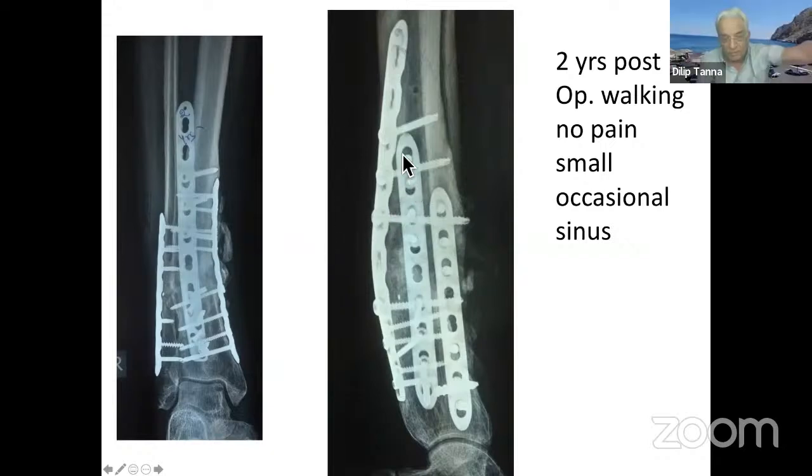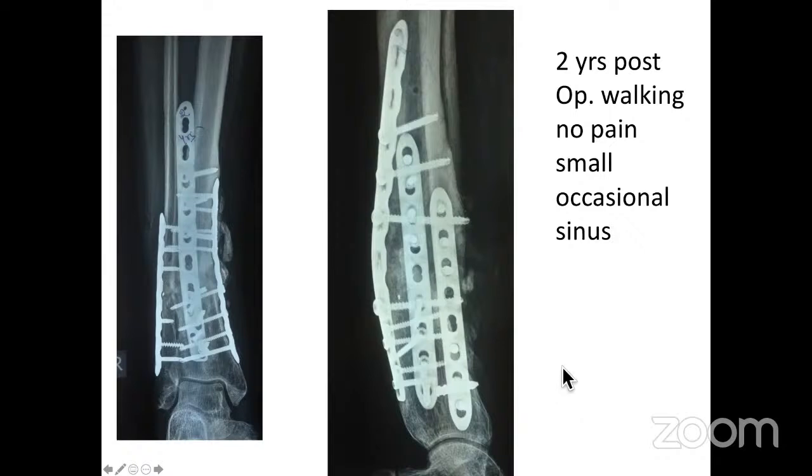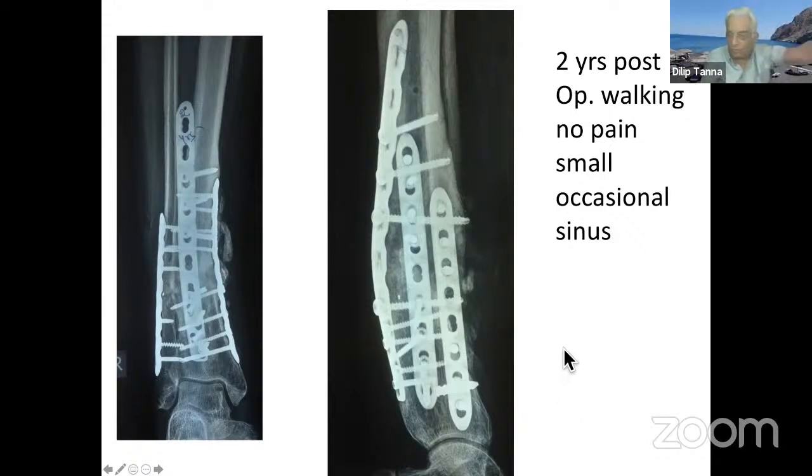Some screws were broken. So continuously 3-4 screws I had to remove by hollow mill. And hence I had to leave 2 or 3 screws, because if I continued the hollow mill so consecutively, it may break down again. So I kept 3 or 4 screws. Out of those 3-4, 2 screws were removed and 2 screws were left. I said we'll take them out at a later time. Fortunately, he has not come and he was phoning me that he is perfectly all right. He's not bothered about those 2 screws and things have become all right.